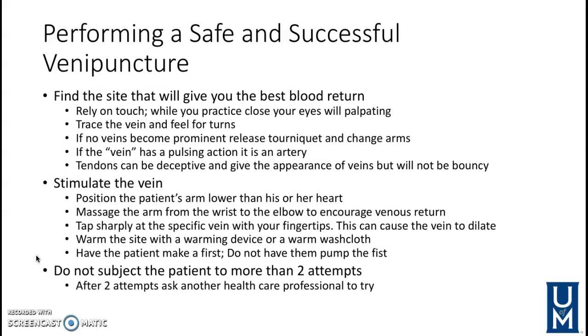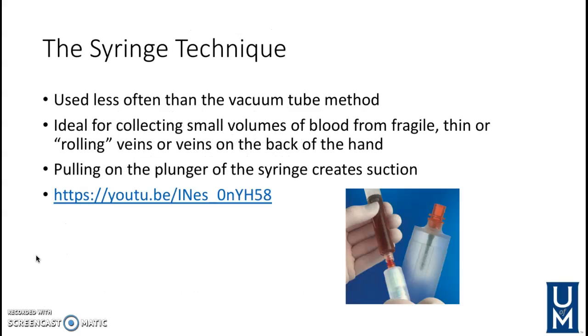You may see different providers asking the patient to pump their fist. This is actually not a best practice. They should make a fist, however, they should not pump the fist. And if you attempt your venipuncture twice and are unsuccessful, you need to stop. After 2 attempts, always try and find someone else, someone maybe that has more experience than you, that can attempt to do venipuncture. We don't want to keep putting our patient through pain and torture just because we're unsuccessful with the venipuncture.